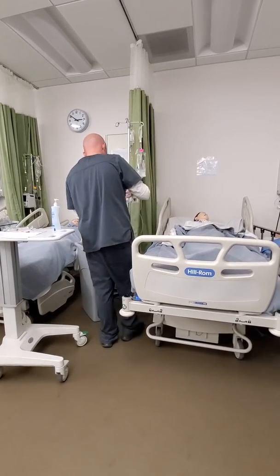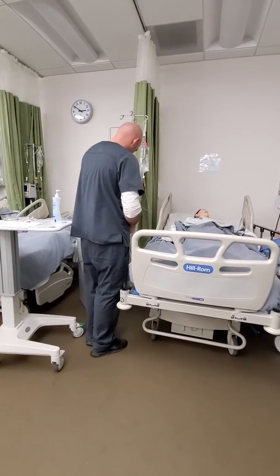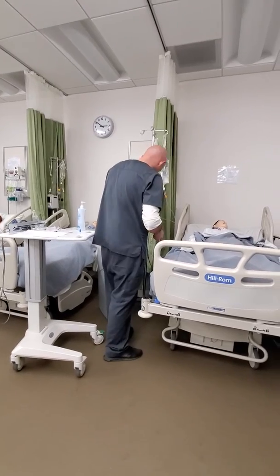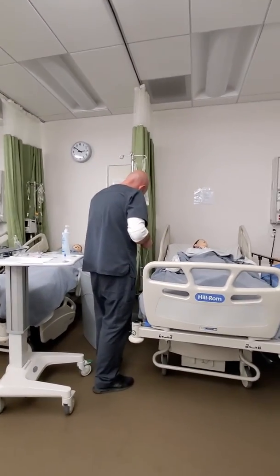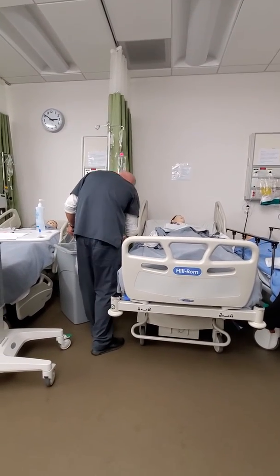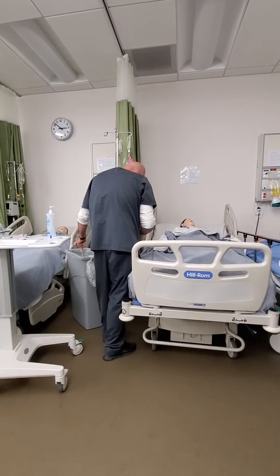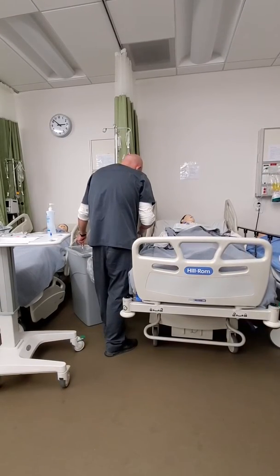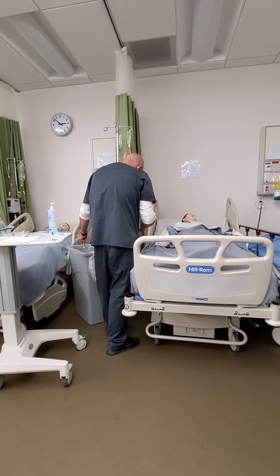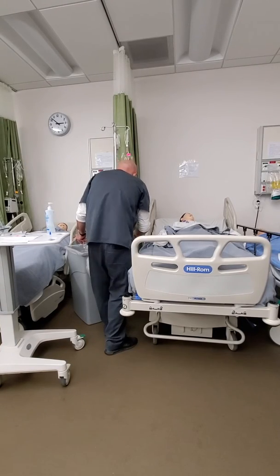I don't know if I'm doing this right at all. So now that it's clamped there, you just have to squeeze that clamp. There you go. Okay. And just follow the last air bubble out. Well, for the sake of this, we'll just say there's no, well, there's quite a bit of air in there. There's a lot of air. So no, there's no air.